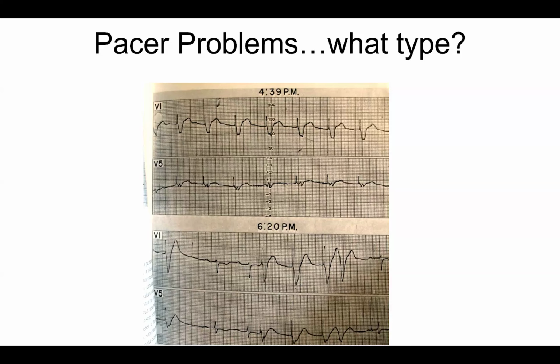The only other issue with electrocautery that I should mention is, in the past, pacemakers were not as well grounded, and very rarely there were case reports of people whose pacemaker circuitry was literally fried with electrocautery and stopped working completely, causing asystole.